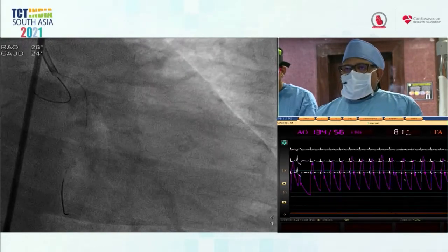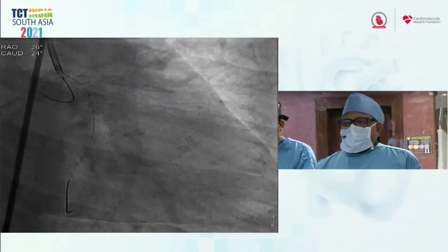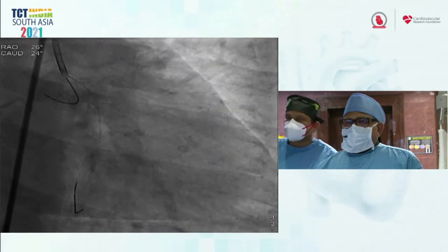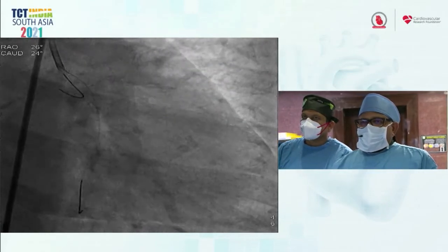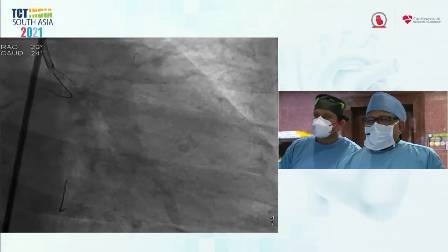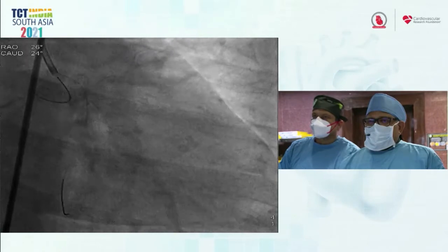So you've got distal landing zone and proximal landing zone, which gives you the length. Your LAD landing zone gives you the stent size, and your left main landing zone gives you the POT balloon size. And you then see the structure of the plaque as well and decide whether you want to get a plaque modification. Okay, that's very nice.